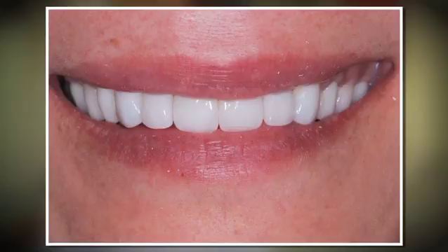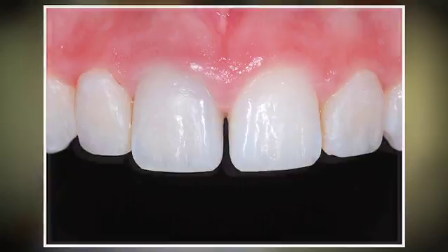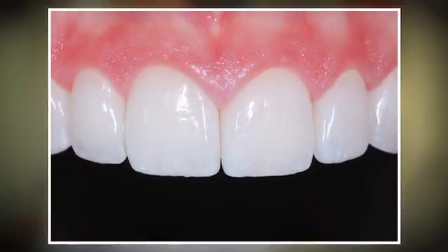Within a couple of weeks, those restorations come back to our office and we meet with the patient and we do a try-in. If all the aesthetic parameters are in place and the patient loves the way the restorations appear, then the restorations are bonded in and the procedure is complete.